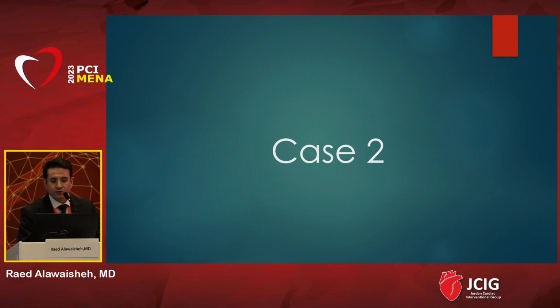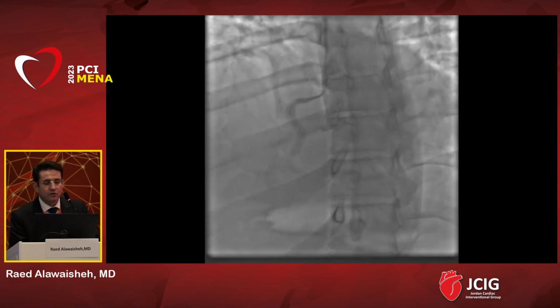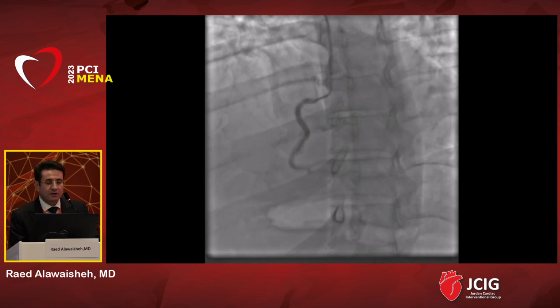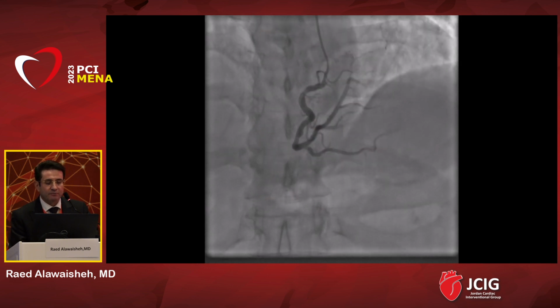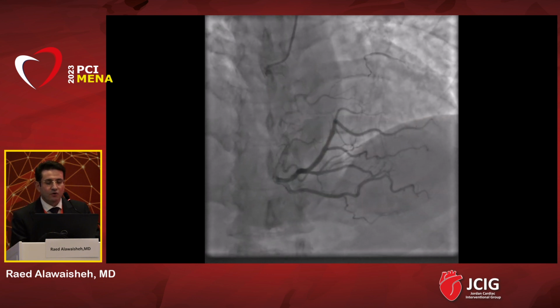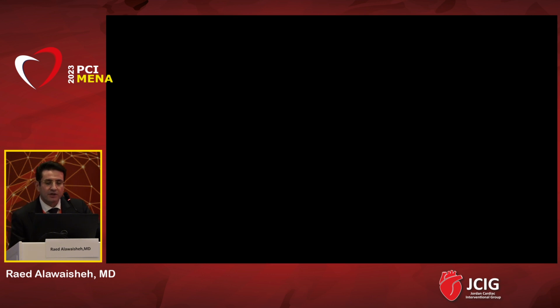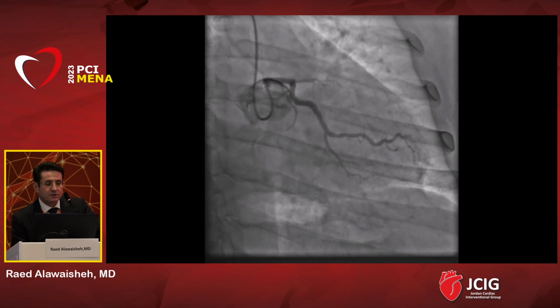My second case is another interesting case, for a patient who also had a CTO on the LAD, and as you can see here by the injection from the right side, you have a dominant RCA, but almost nothing, just a shadow there in the upper corner of the screen. You can see something filling there, but you cannot appreciate a real LAD vessel.